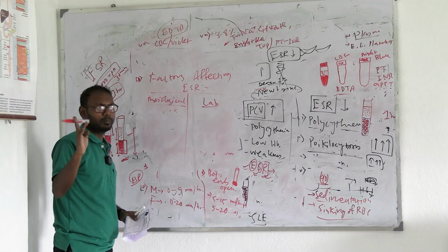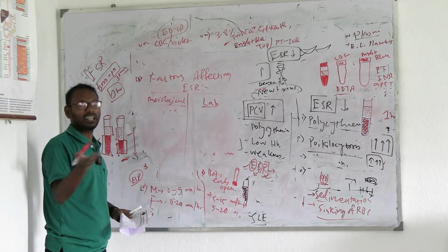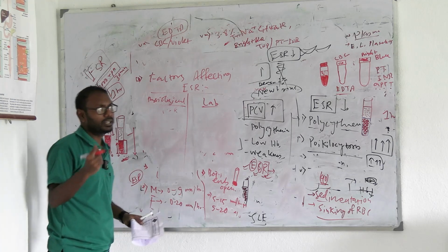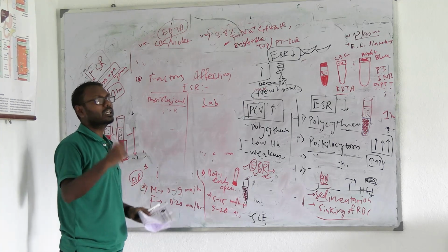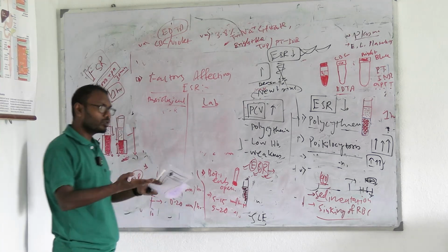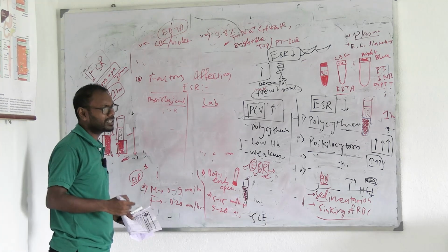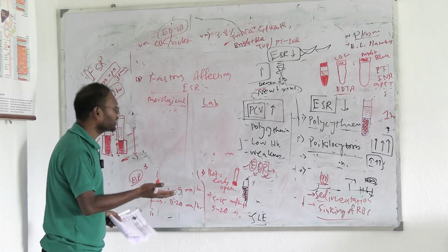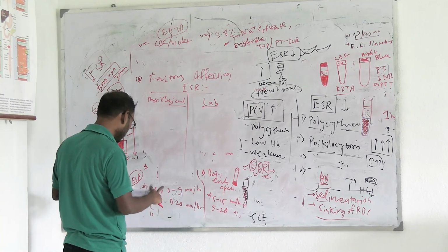মনে করো in case of hemoglobin estimation or all those things, or in case of WBC, Neubauer's chamber, all of these things আমরা বারবার বলি যে keep it well. Okay, তুমি যে ল্যাবের ইনস্ট্রুমেন্টগুলো ইউজ করছো, keep it free from contamination, handle those instruments properly, don't shake those things unnecessarily. So just like that, here are also some lab factors, because these include multiple instruments, so there are some lab factors which can affect ESR. বললেই বুঝতে পারবে কেন, এক্ষুনি বললে বুঝে যাবে.